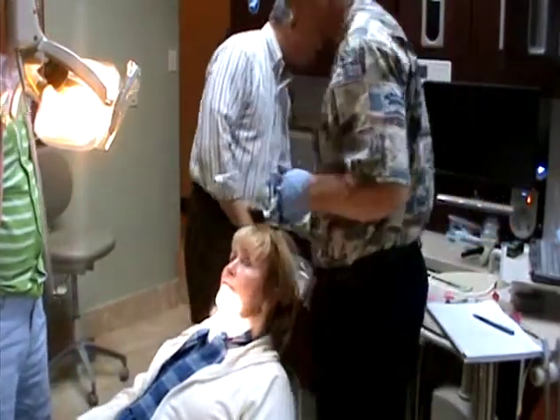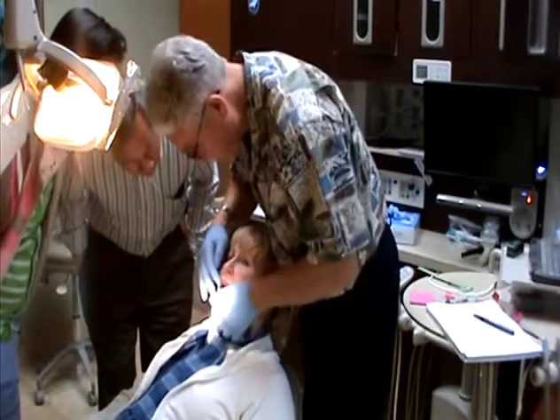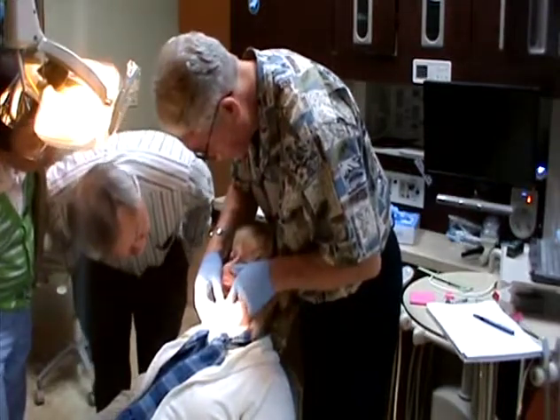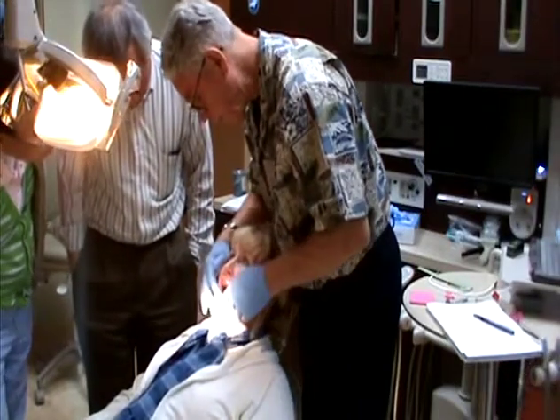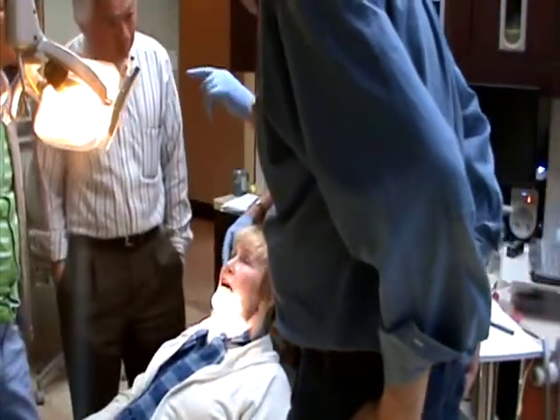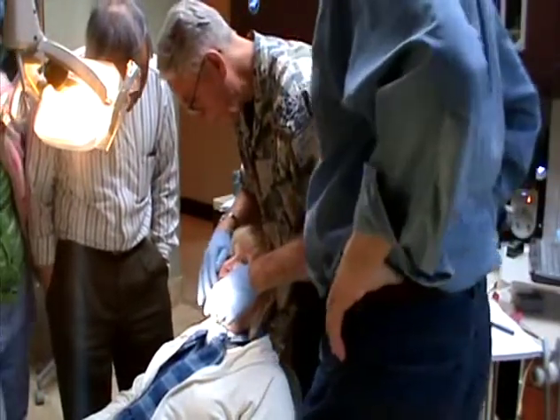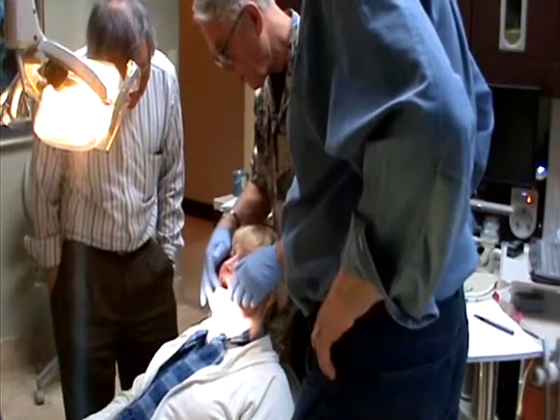You've got to just draw a picture and show what you've got to do on there. Okay, I look in here. So you're functioning off of these two, right down. You're pretty good right here. What you've got to do is pull these two teeth up to this level and this tooth up to this level. So what I do with these is I take this 016 wire into the molar, and I put a great big up bend in it. I go from the bicuspid to the molar with a big up bend in there. And then I have her wear a triangle elastic, hooked onto this one and two up here.